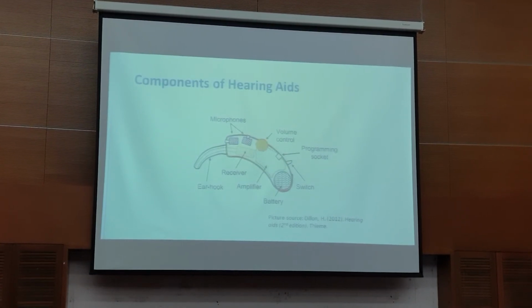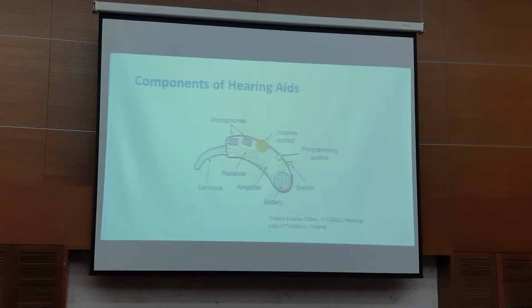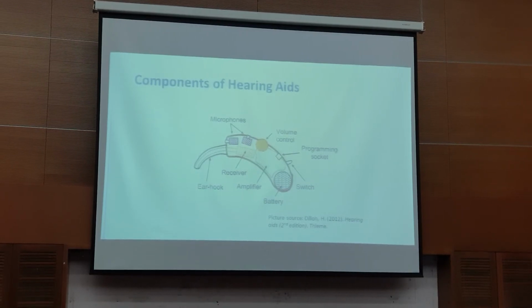But if the cochlea is the problem, yes, you amplify the sound, it gets in, and then all the sound sampai balik ke otak untuk the process. But then you have damage to the outer and probably the inner hair cells as well if the hearing loss is very, very severe.